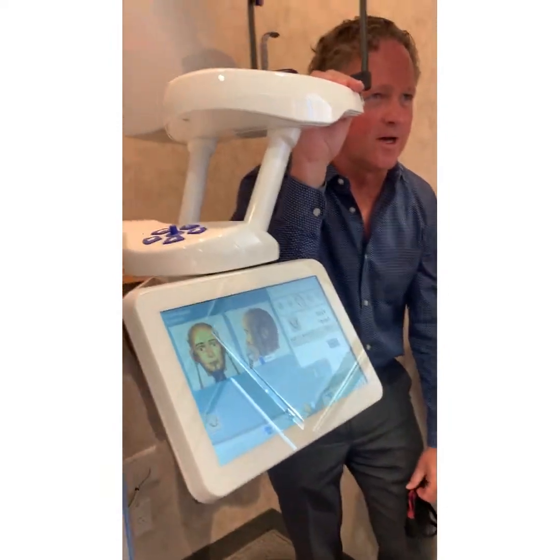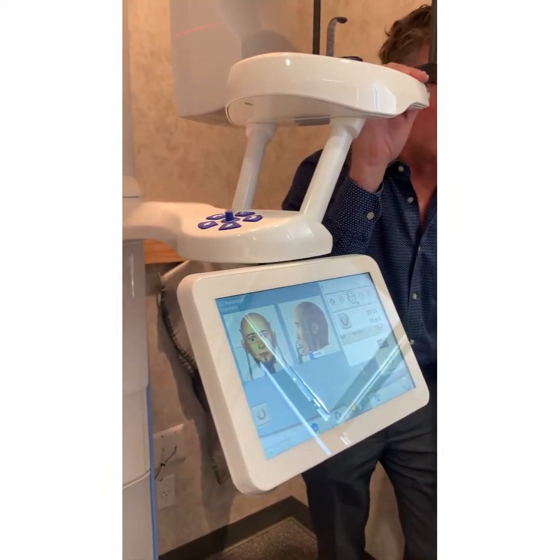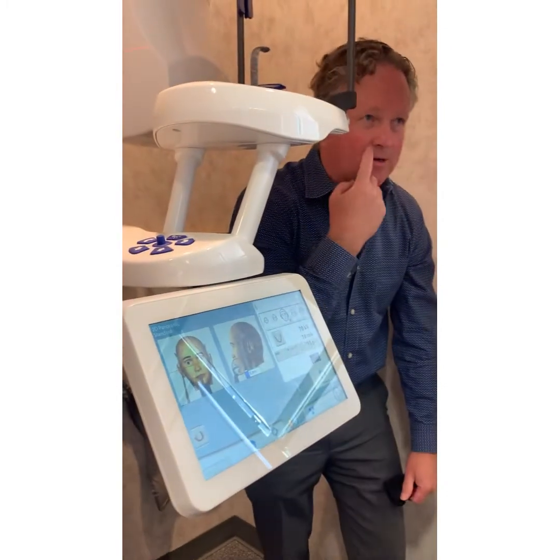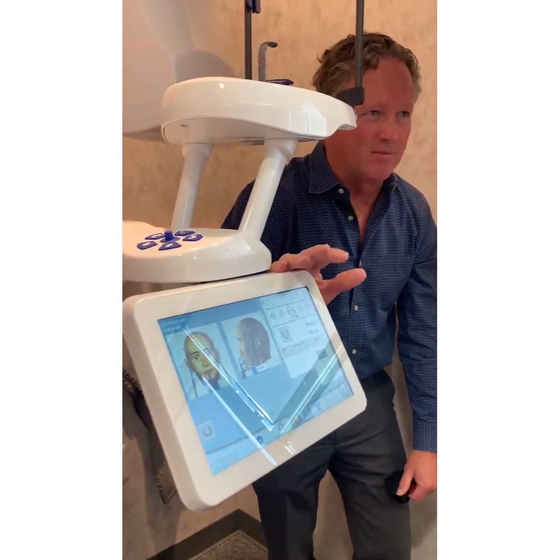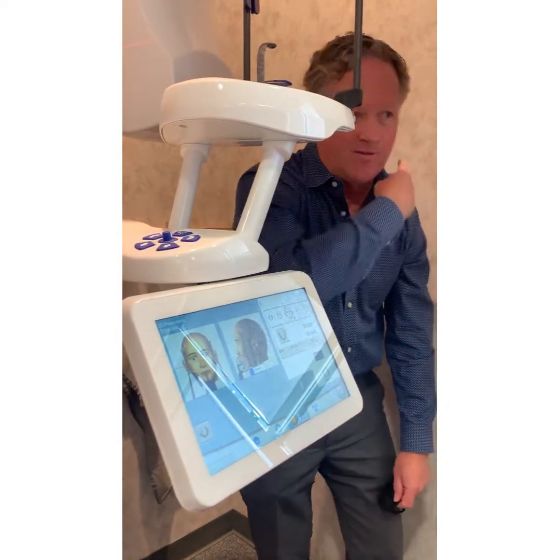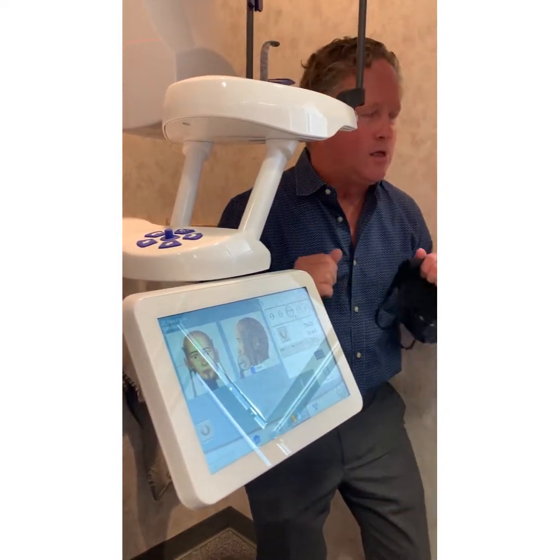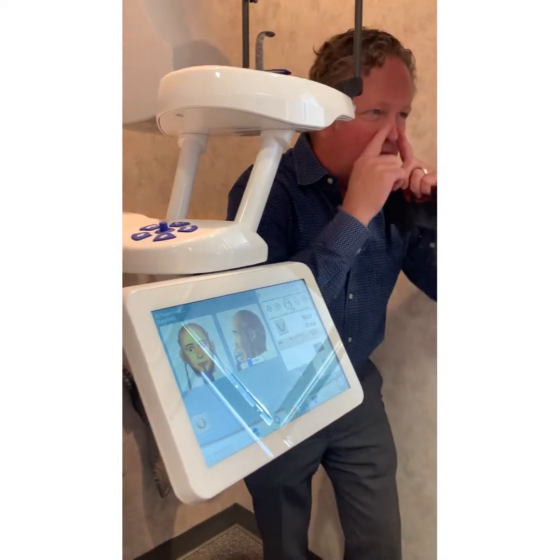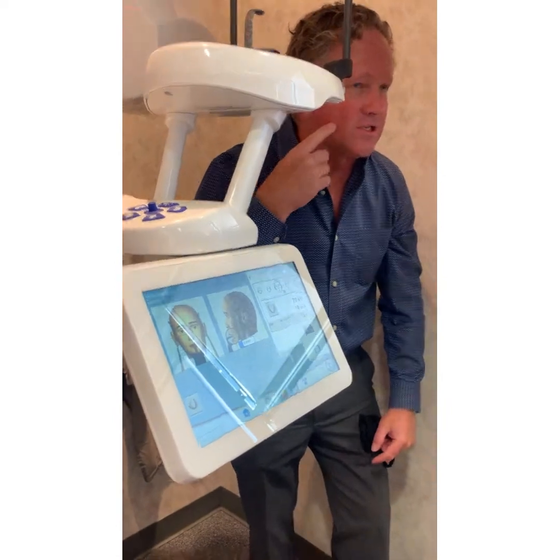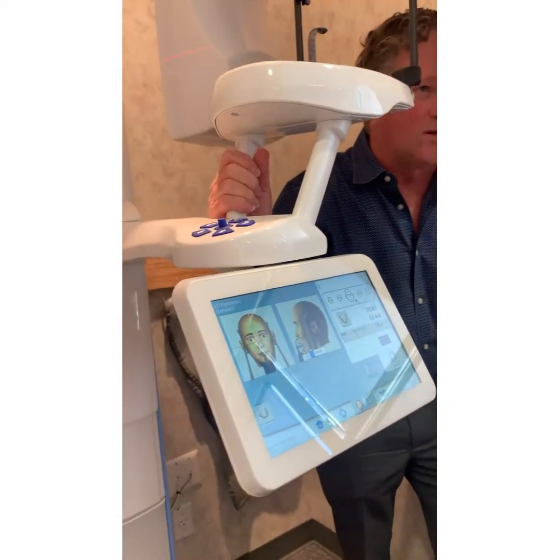You know, the tongue in the roof of the mouth, swallow, breathe through your nose. Air has always had a detrimental effect on radiography. So if you have a dark splotch here, it's not because you messed up on the quadrant and the density, it's because they breathed around the bite stick during the exposure. If you have a big dark band all the way through, it's because they're breathing as it goes. It should be dark around the septum, and there should be a thin dark line because the airway is still open. It just doesn't intrude on what you're trying to see.